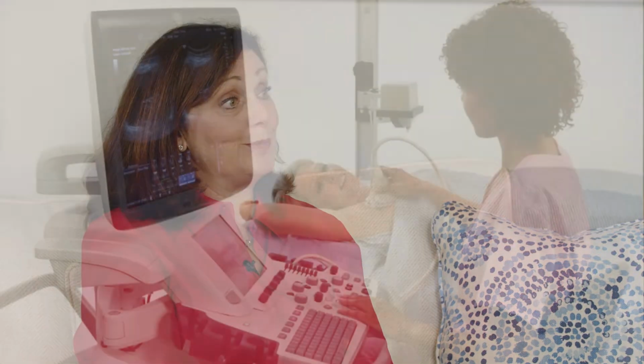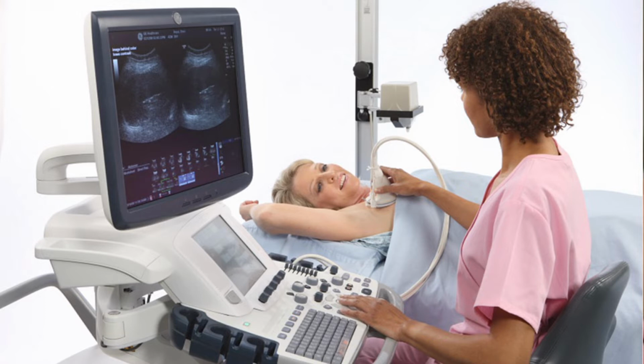We found that initially, the legacy technology of screening breast ultrasound is very effective. We find 25% more breast cancers with screening breast ultrasound in women with dense breasts. And the thing to remember about these cancers is that they're really important cancers. You might say, well, every cancer is important, right? But these are small, invasive, almost exclusively node-negative cancers. So these are killer cancers that if we find early, we can cure.